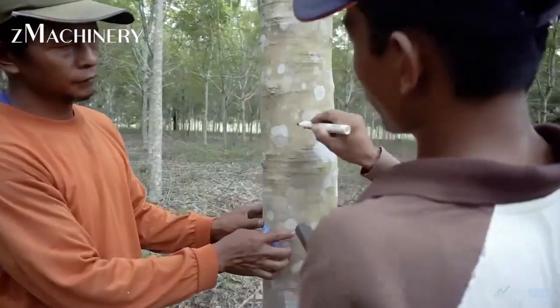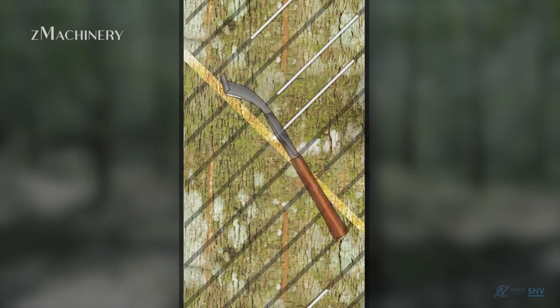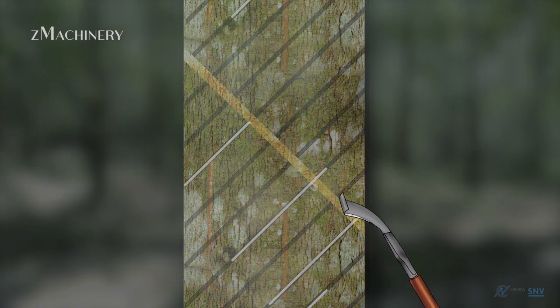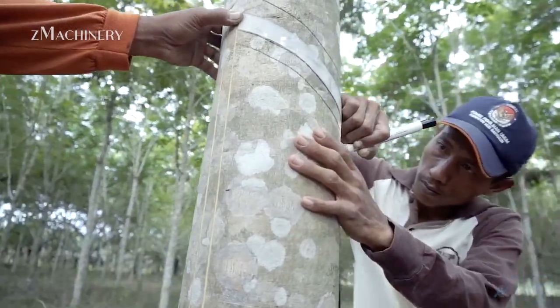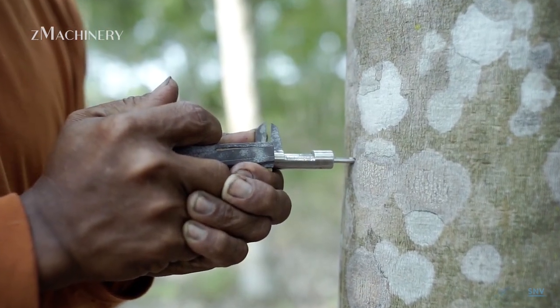Hello everybody, welcome back to Channel Z Machinery. Have you ever wondered how a condom is made? It's a fascinating journey that begins not in a factory but in nature, with a tree known as Hevea Braziliensis, or the rubber tree.